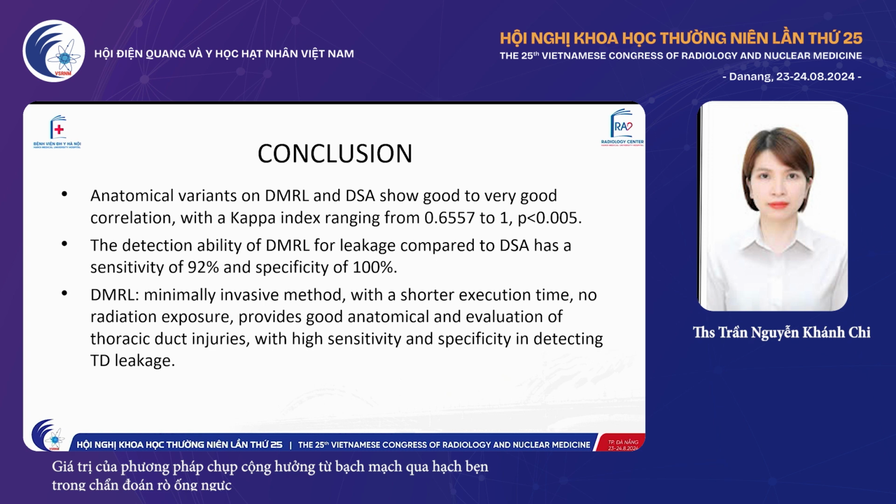Based on the research results, we draw the following conclusions. In anatomical assessment, MRI shows a good to very good correlation with DSA. The detection ability of MRI for leakage compared to DSA has a sensitivity of 92% and a specificity of 100%.